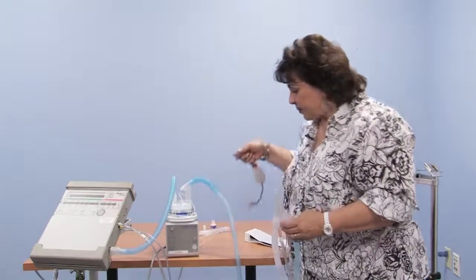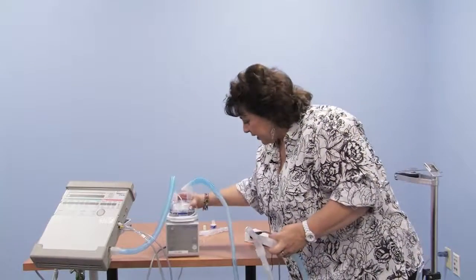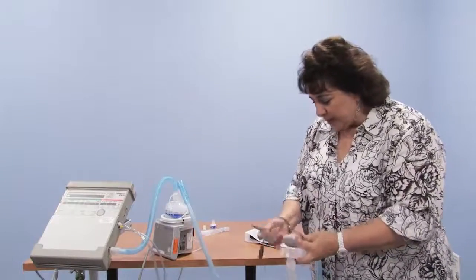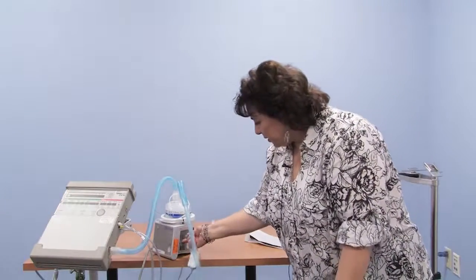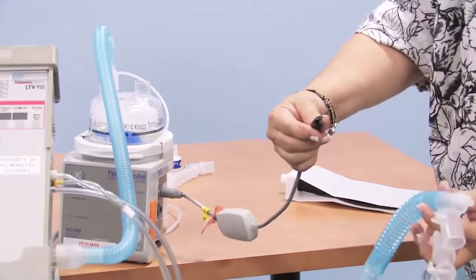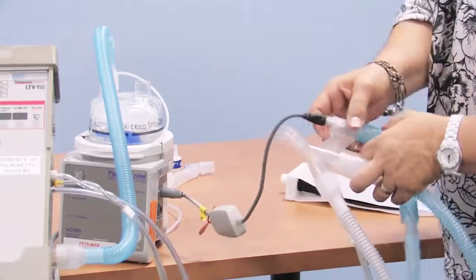This one requires a piece to go to the wire on the circuit. And on the side here, it says heated wire. So I'm going to attach the heated wire attachment. And on the ventilator hose, there's a place for the wires to be connected so that the machines can now work together.